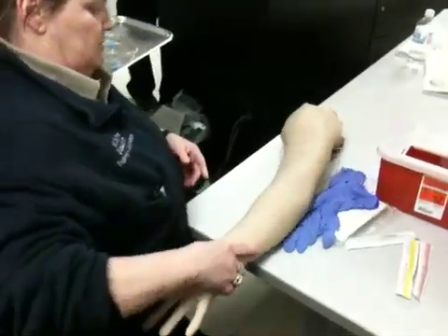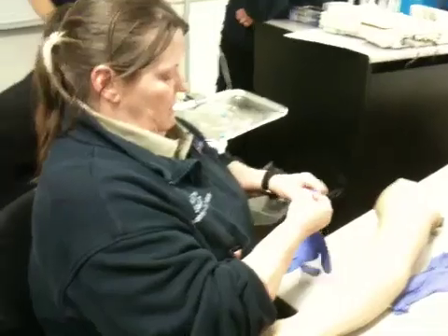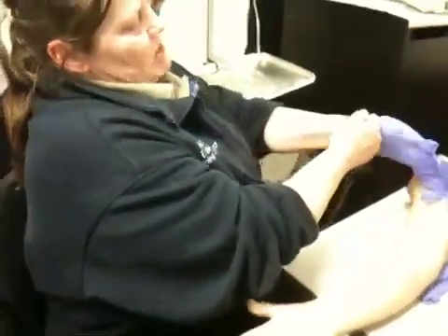We have several sizes out here because I don't have a clue. I know her veins should be small, correct?